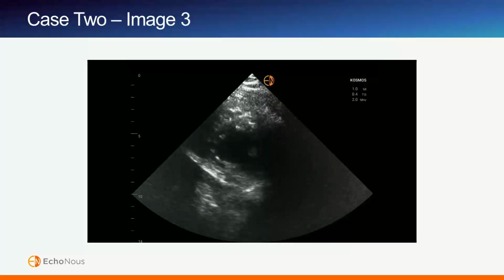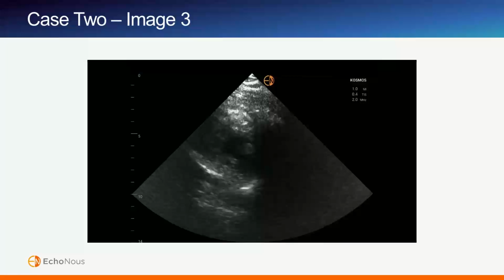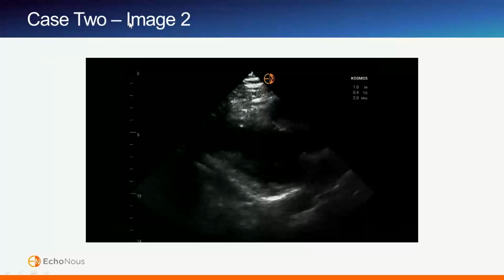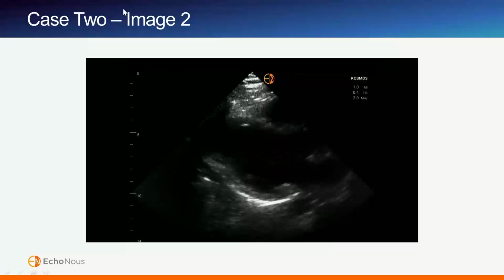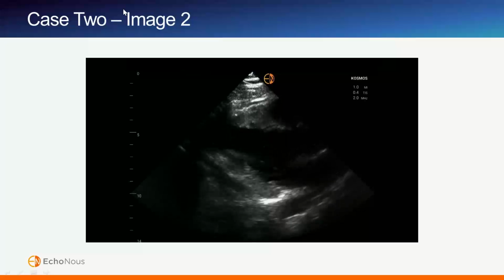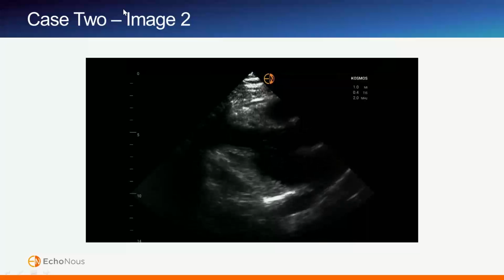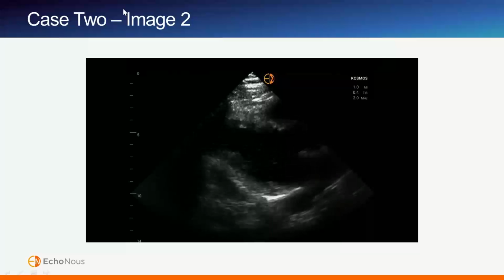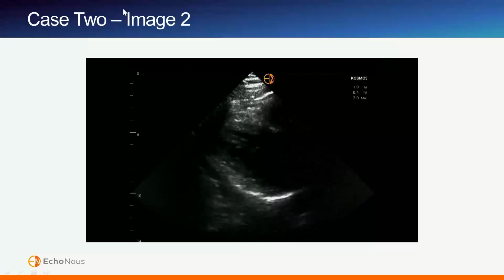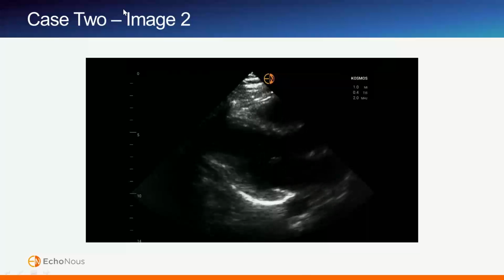If you go back to the parasternal long view, you're right, we don't usually use that view to compare the RV to the LV. But we generally use it to look at the diameter of the aortic outflow tract and the size of the left atrium. They do look about 1-to-1, which is a cheap way of saying that the RV probably isn't too enlarged compared to the other views. So long as you have a good parasternal long view, that's another way to compare the three chambers.